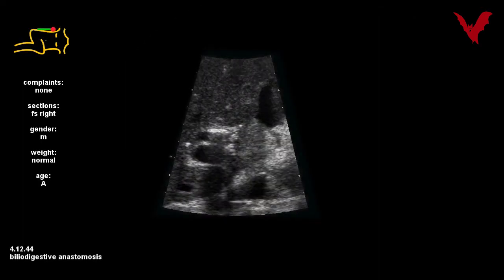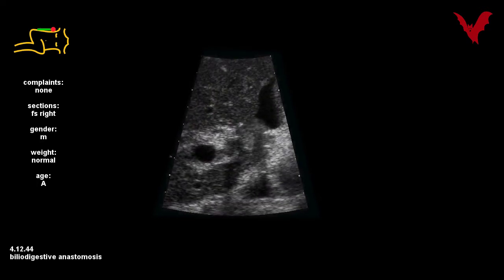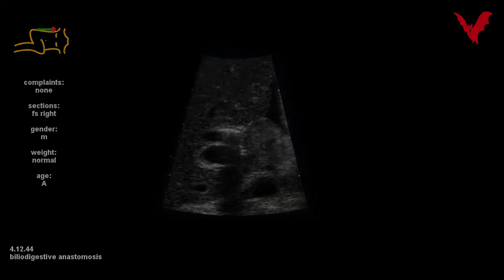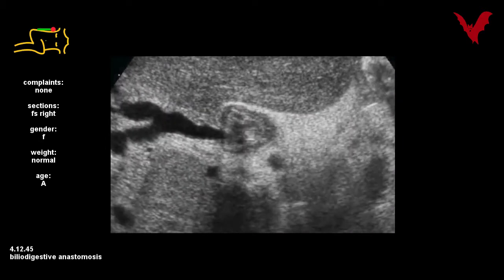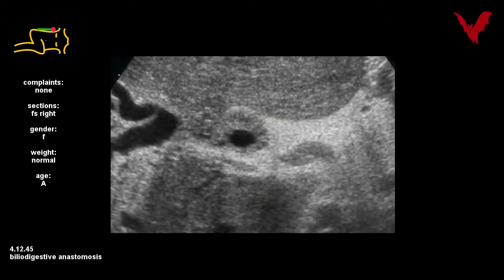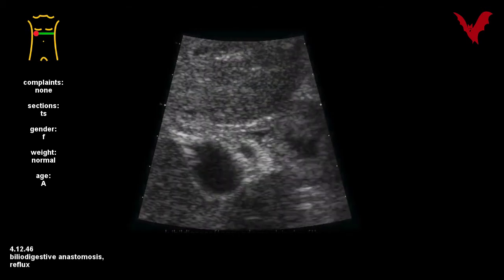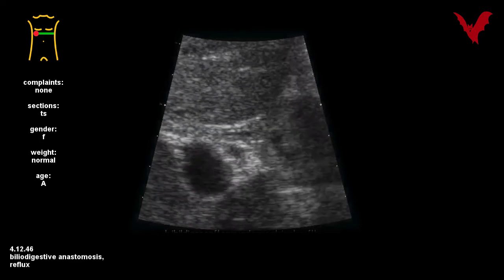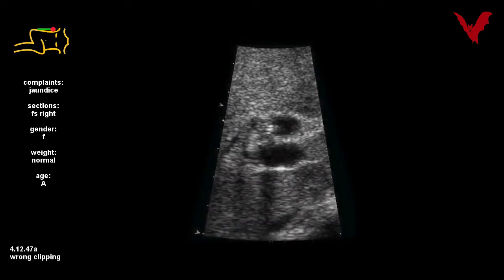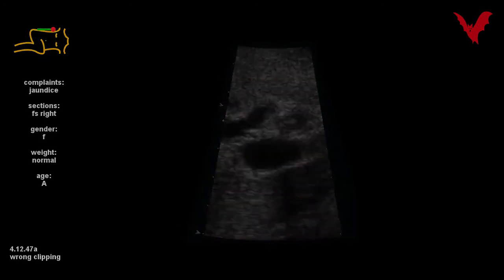These anastomoses were well visible in clinical ultrasound, with bile flow and peristalsis in 44, proving absence of an outflow obstacle. And please note on the opposite a mild but significant hindrance of biliary outflow in 45, and even suture clips in 46 are displayed, which otherwise shows normal diameter of the DHC. Please note the detailed information given by clinical US.